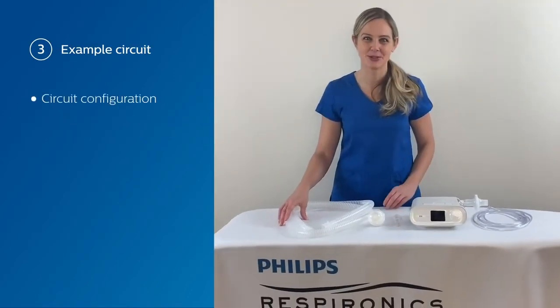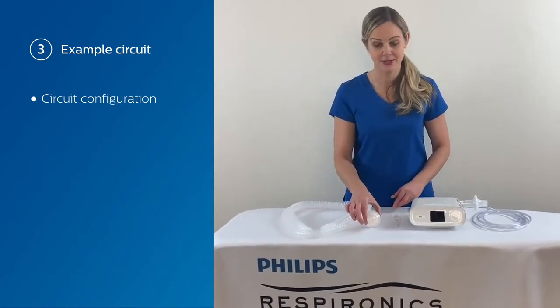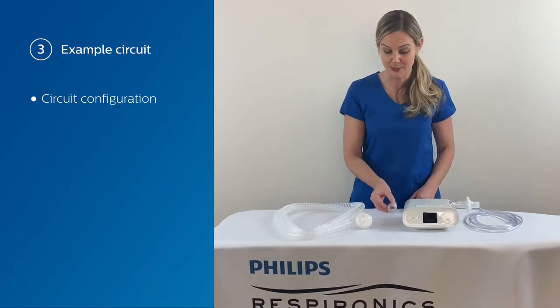Next, we're going to go through an example circuit setup for the device. You'll need tubing, a bacteria filter, and an exhalation port — also referred to as a leak valve. This is needed if you're going to be ventilating with a non-vented mask or for any invasive patient.